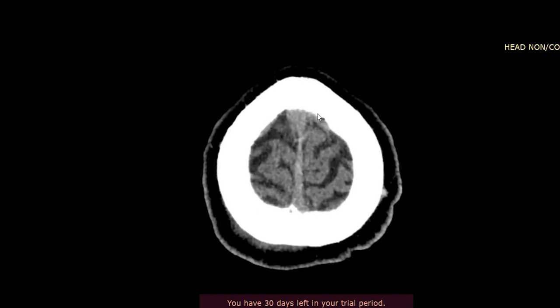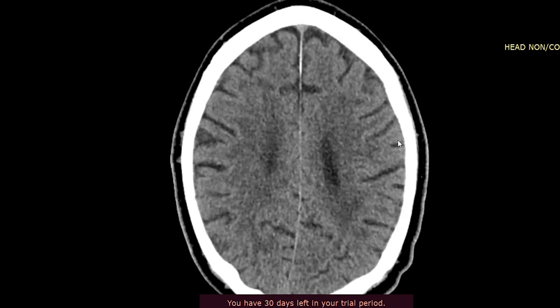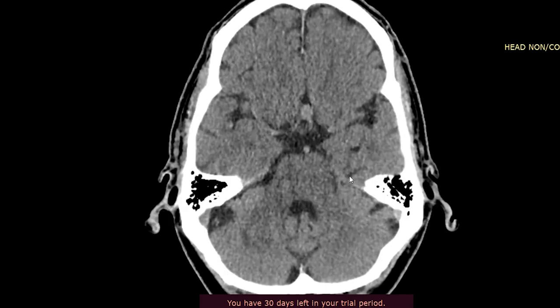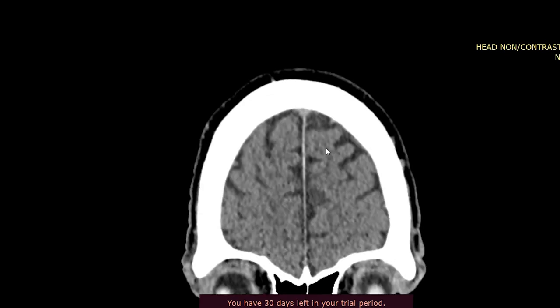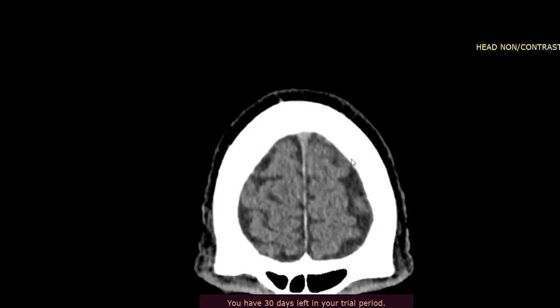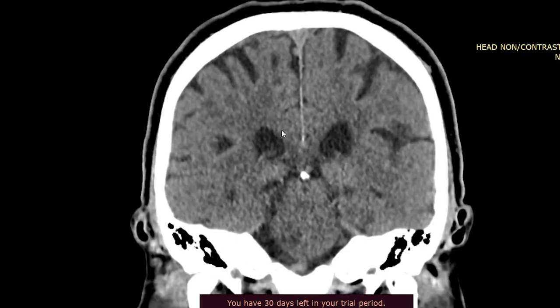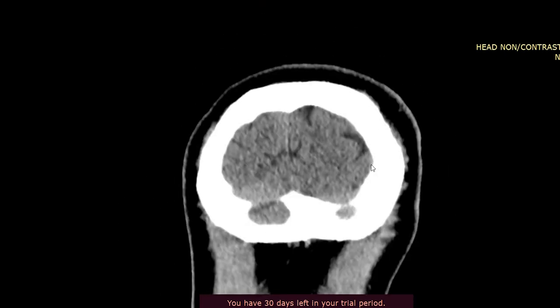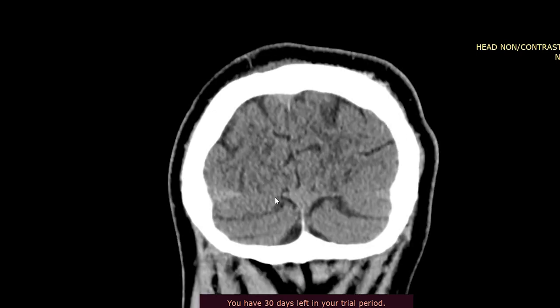Looking through the parenchyma, I don't see any hemorrhage. The next thing is to look for extraaxial hemorrhage — extradural and subdural hemorrhages — which usually sit along the convexities of the cerebral hemispheres. Looking along the margins — usually by the time you're doing this scan you'll be looking for hyperdense blood product. It's always important to look through other planes as well; a coronal sequence is very useful, particularly along the convexity, to pick up subtle hemorrhages. Scrolling through, it looks nice and clean.